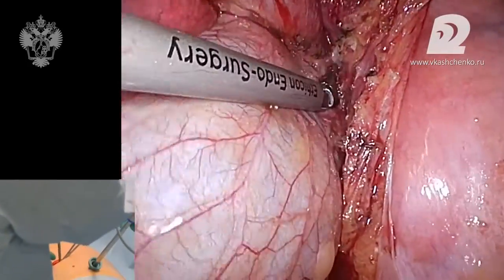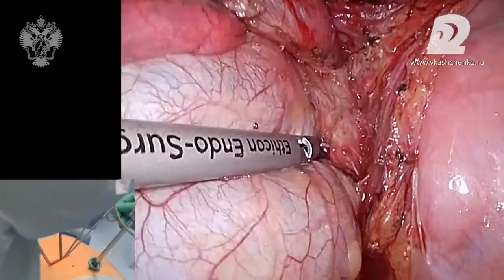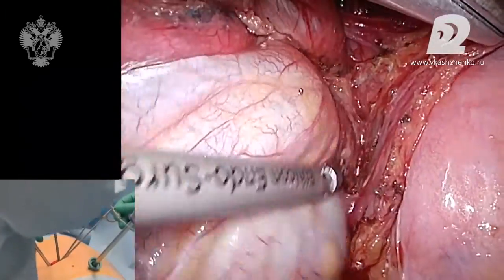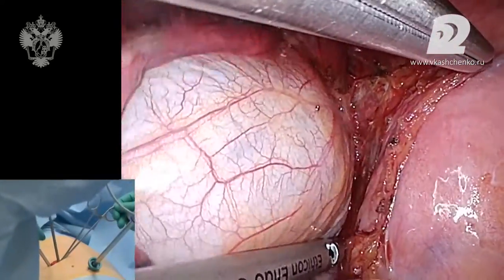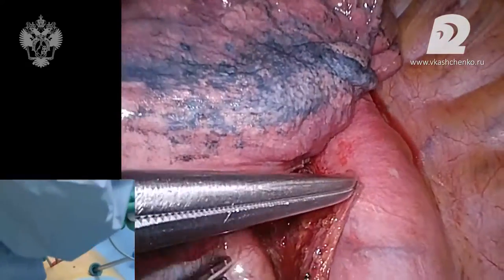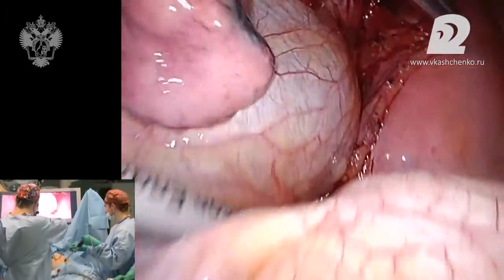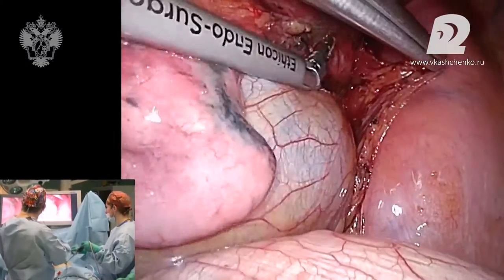So, Vadim Grigorievich, if you can, tell us about what is happening. Generally speaking, you can see the pericardium here and the inferior pulmonary vein, and now we are working in the opposite field of the pericardium. You can see we are just working along the vessels. The cranial end is above, and this is the descending aorta. The caudal end is downwards. You can see the landmarks.